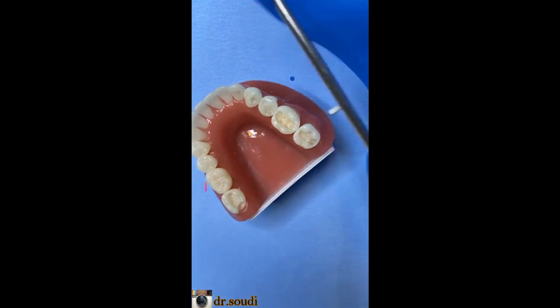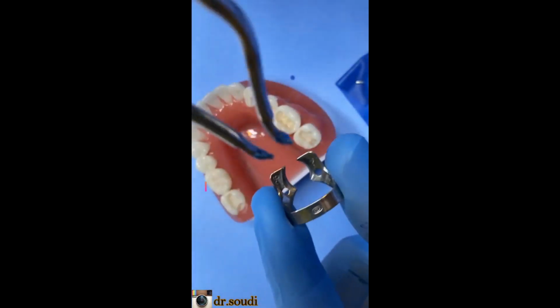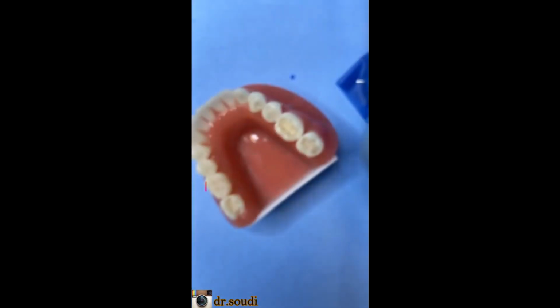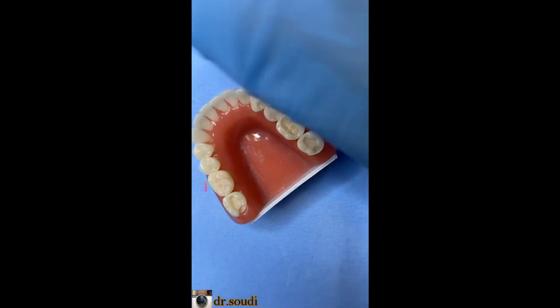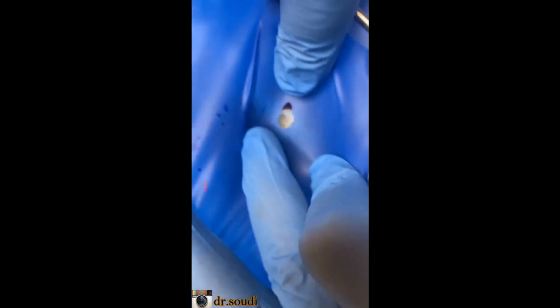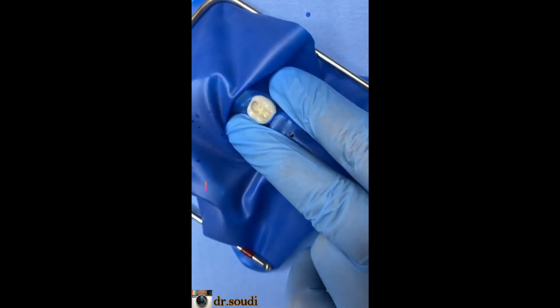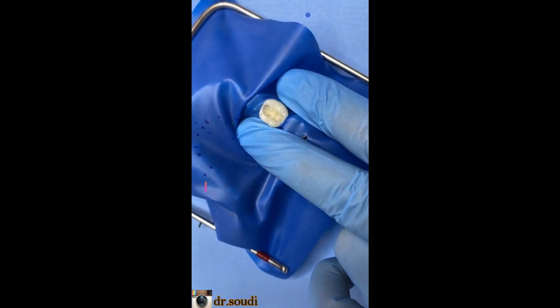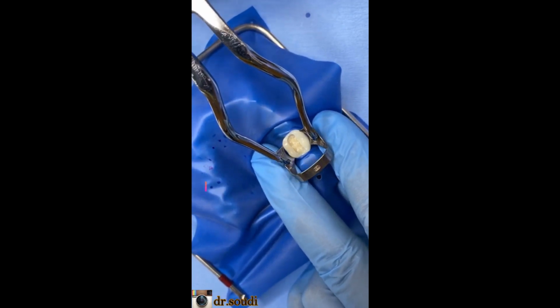You have your sheet, okay? Make your clamp ready with the forceps, okay, like this. The first technique was place the clamp within the sheet. Now we will put the sheet then the clamp, okay, the sheet like this. You can hold it like this with your two fingers, okay, and then your clamp like this.